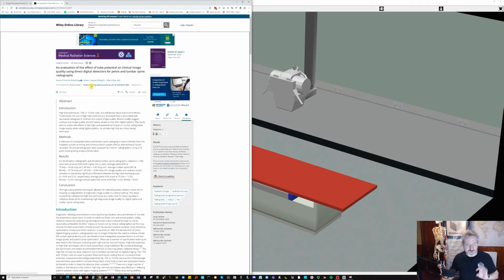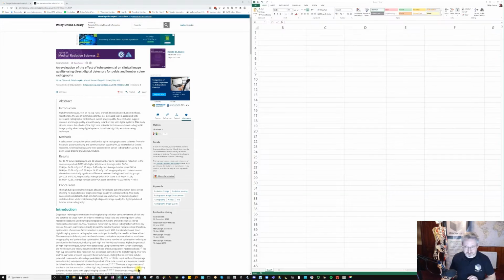So in this video, what I'm going to just do is read the paper, not critique it, but read it and find out what the experiment entails, and generate our own data capture form that I'm going to put in a spreadsheet here. I'm ready to do the experiment in virtual radiography. Okay, so in reading the paper, what we need to know is what the independent variables are.